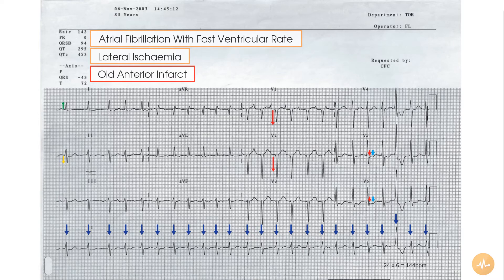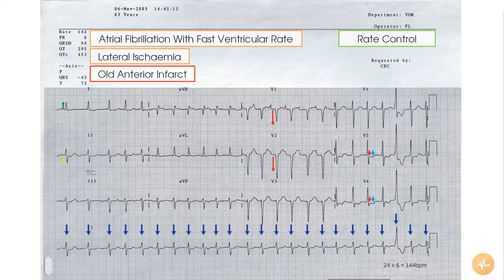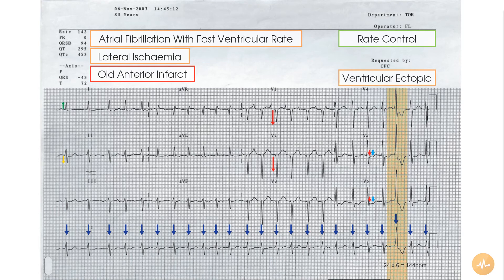Gaining rate control of the tachycardia would be the first step in managing this patient's compromise. Of both insignificant and incidental note is the presence of a ventricular ectopic towards the end of the recording. Thank you.